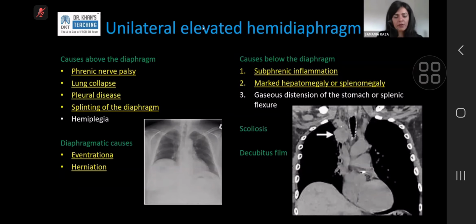I will focus on some ways that lung cancer can present. So obviously there are the signs and symptoms like hemoptysis or unexplained weight loss or chronic cough and stuff like that. But what on imaging can make you suspicious for underlying lung cancer? The appearances that you often get presented with, at least in an exam scenario or real life even, are ancillary findings. So you can talk about diaphragm or pleural effusions. We'll go through those one by one.